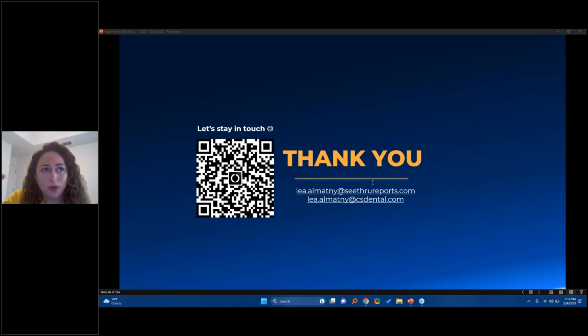You also have the possibility to take a high resolution scan with a 5 by 8 field of view. That vertical scan on one side is only on the 8200 Neo. Fran, if I'm mistaken, let me know. But I think the difference is the field of view and the acquisition platform.